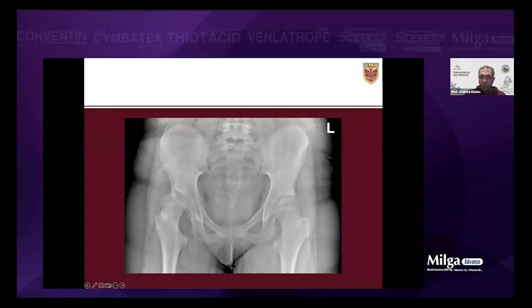Then we did the varus osteotomy. Before you do the varus osteotomy, I did the range of motion under fluoro to see what amount of abduction I need to get enough coverage. And I do a little bit less than what I see because she's ambulatory. So always keep in mind that she's ambulatory. Even for the psoas release, don't do it from the distal part, do it from the pelvic brim because she needs some flexion for function.